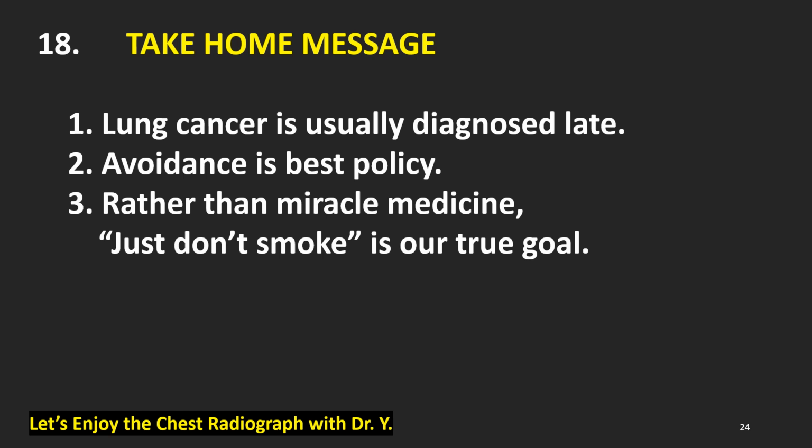How do you feel now after review of chest radiographs? Everyday chest radiographic findings of lung cancer. Somewhat fearful, somewhat interesting. Okay, let's take home messages today. 1. Lung cancer is usually diagnosed late. Late diagnosis, that is a big problem. 2. Avoidance is the best policy against lung cancer. 3. Rather than development of miracle medicine against lung cancer, just don't smoke is our true goal.